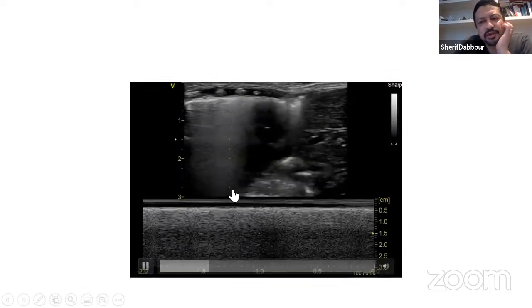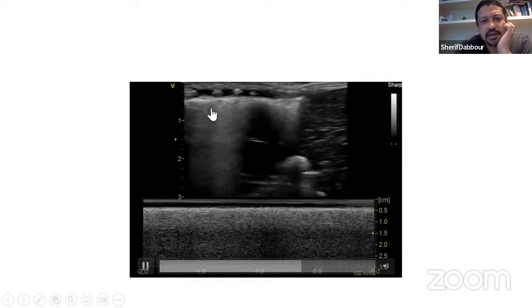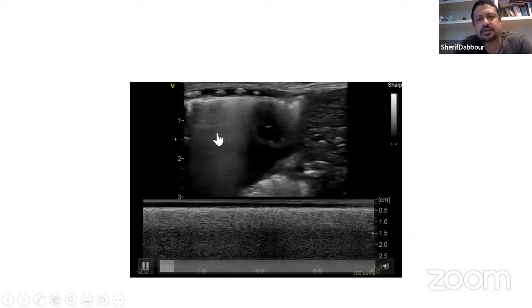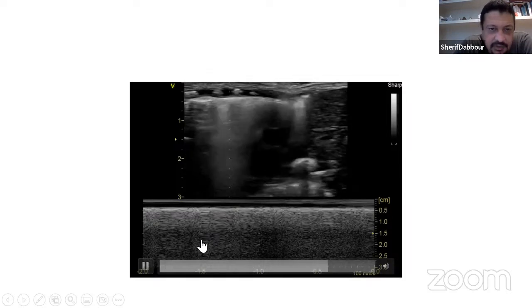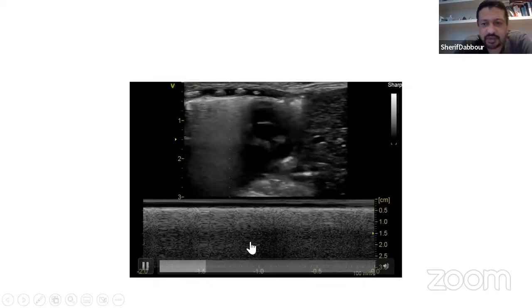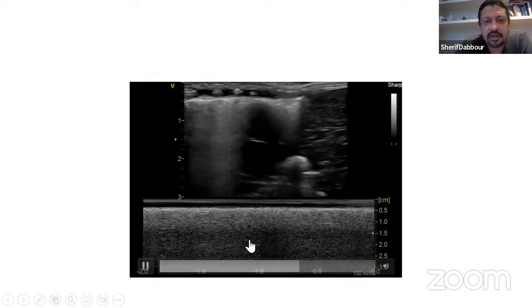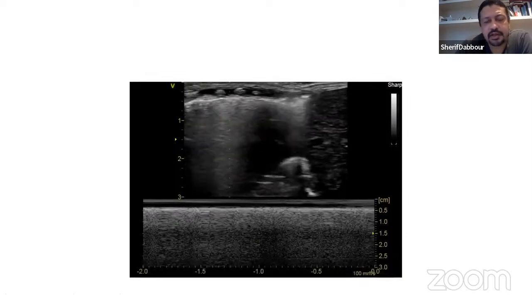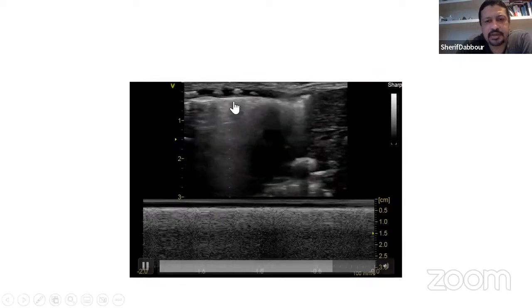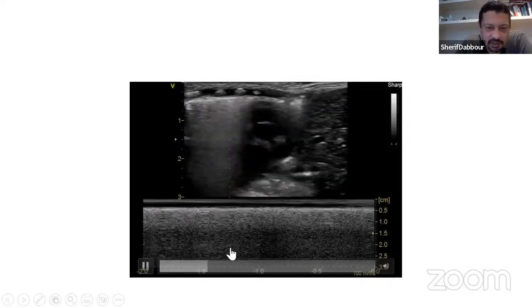I actually completed my presentation, but I would like to mention something. I put on the M mode. I'm still at R1, which I can see clearly here. I can see the heart coming into the way, but I could also appreciate some pleural sliding. In the M mode here, I could see a mix of barcode and sandy beach sign, and I don't have an explanation why the barcode sign is there. I tried to put the cursor in many areas, but it gives me the same picture, a mixture of barcode and seashore sign.